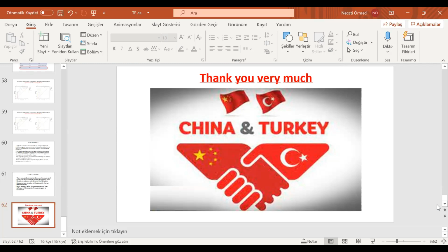Thank you very much. I also agree with this, because in our study we also found that 25 is a very good cutoff for large-sized esophageal varices.